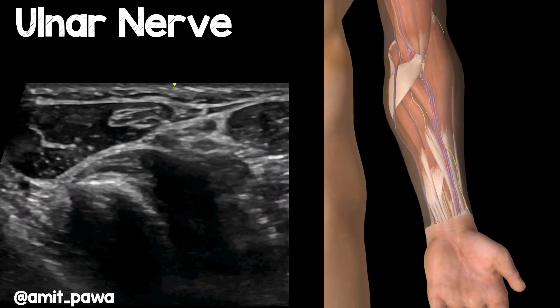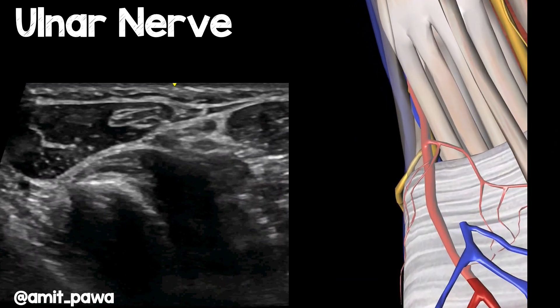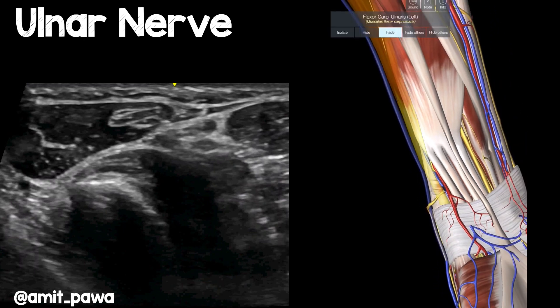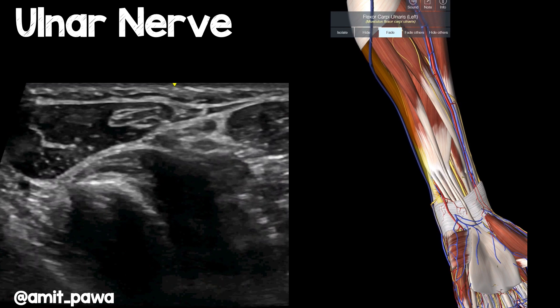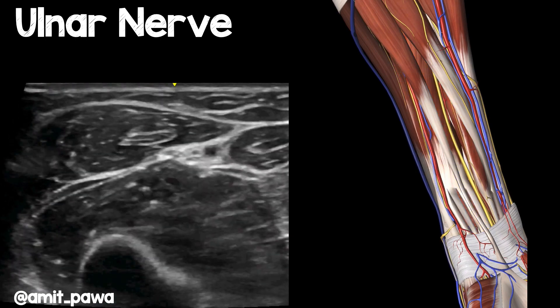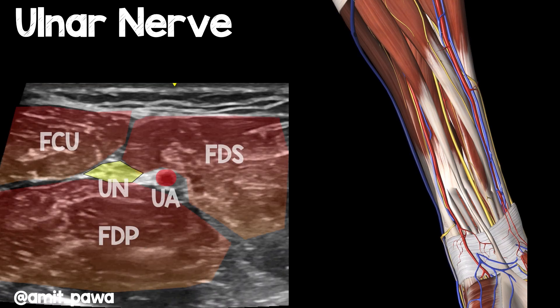What about the ulnar nerve? I often try to start scanning right down at the wrist, where you'll identify the ulnar artery, and the ulnar nerve tends to lie on the ulnar side of the ulnar artery. Zooming in on the wrist, you can see the ulnar nerve coming right out there, the ulnar artery, and flexor carpi ulnaris on the ulnar side. As you scan up the arm, there's a point where the ulnar artery leaves the ulnar nerve — that's often a good point at which to block that structure. You've got flexor carpi ulnaris, flexor digitorum superficialis and profundus, and the ulnar nerve sandwiched in between those muscles.